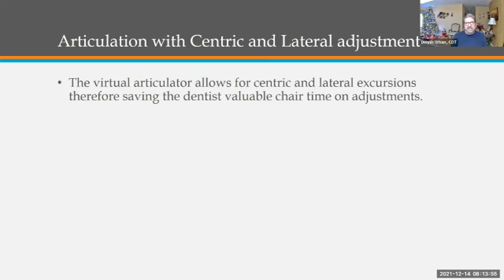The articulation with the centric and lateral adjustments with this software is fantastic, because the virtual articulator allows for centric and lateral excursions, saving the dentist valuable chair time on adjustments. And one of the things I mentioned in the previous presentation was dentists and their comfort, who are having difficulty getting in the comfort zone with the removables, because of all the chair time, adjustments on the occlusion, adjustments on the tissue side. A lot of this is eliminated with digital technology if it's done correctly.